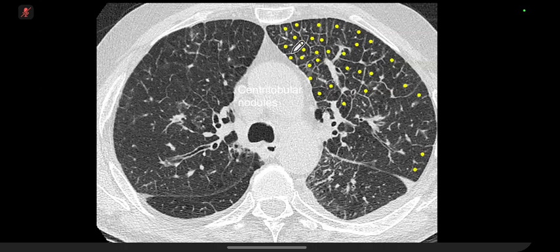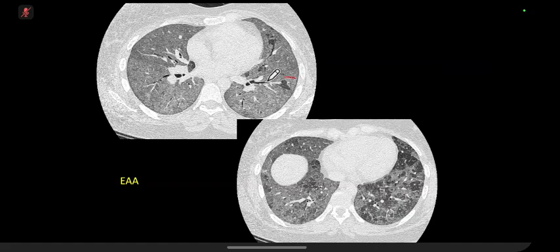Now, in this patient who's got pulmonary edema, it describes very nicely where the secondary pulmonary lobules are, because we've got interstitial pulmonary edema, and the centre of the lobule, they're kind of all equidistant from one another. And so when you get a centrilobular nodule, they tend to be equidistant from one another. They coalesce to form this ground glass change, and then you get this air trapping and very prominent air trapping, as you can see.